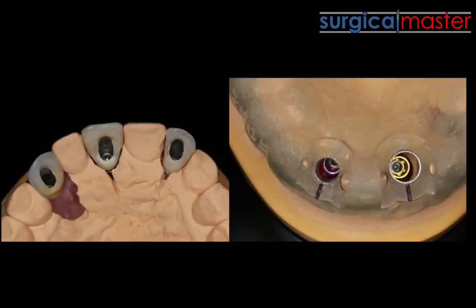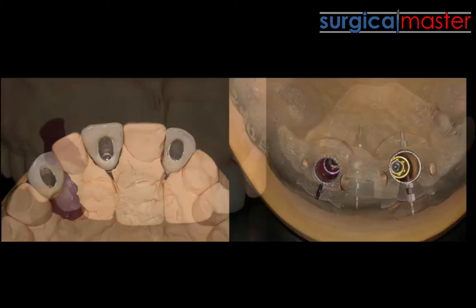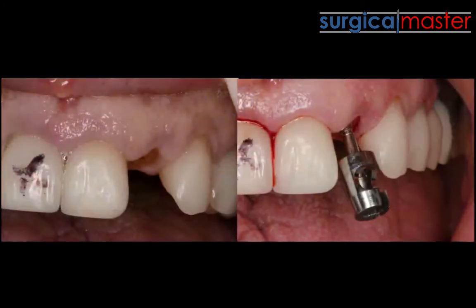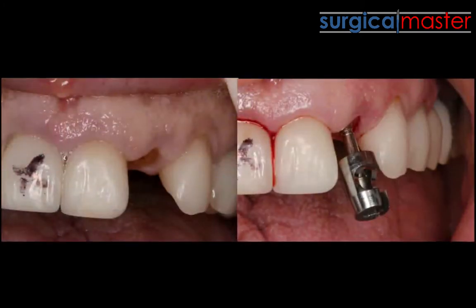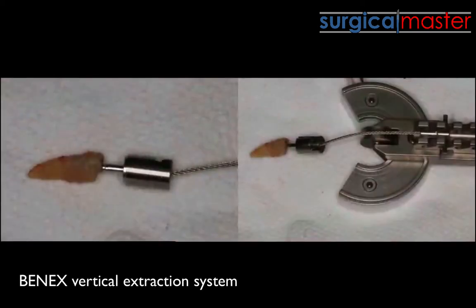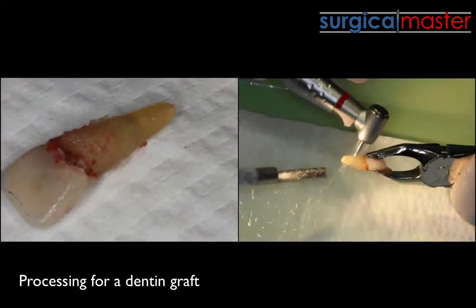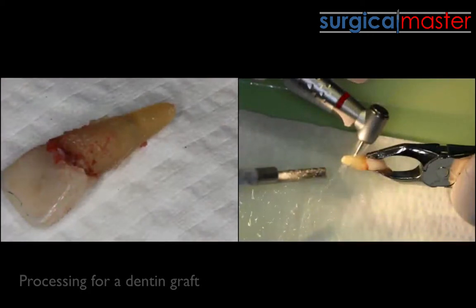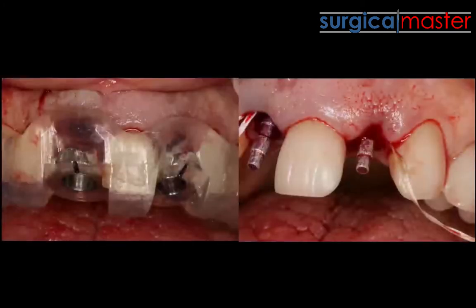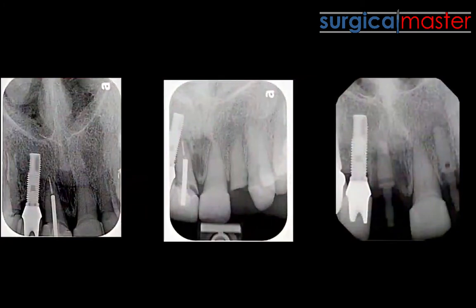The technician had everything set with two provisionals ready to go. I used my Ben-X extractor to extract number 10 — a difficult extraction that became very simple with the Ben-X. I used number 10 as a dentin graft, getting a lot of graft material, because I'm grafting the gap after placement.